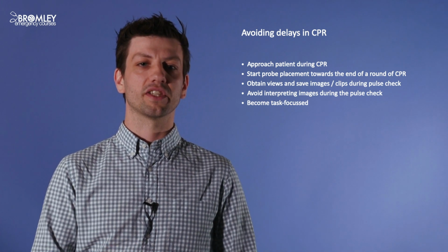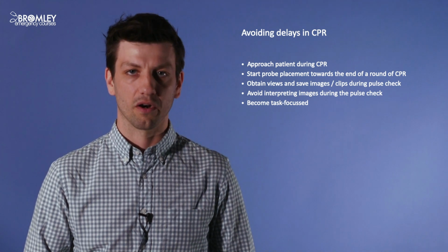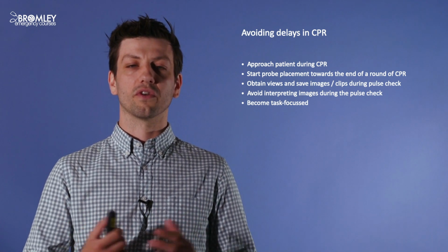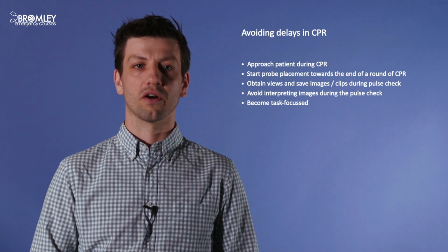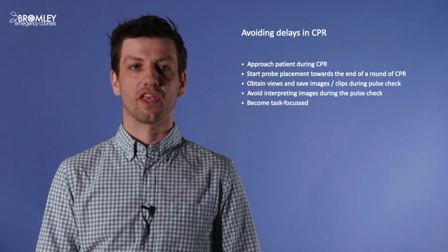This means that I'm limiting the amount of time that's being spent doing the echo and I'm less likely to cause delays in CPR. I think this is one of the only times where you really want to become task focused, and I would advise strongly not to be doing any other jobs during this CPR. So don't do the echo if you're the team leader, and don't be picking up other tasks other than the echo. So we'll start with talking about cardiac activity or cardiac standstill.